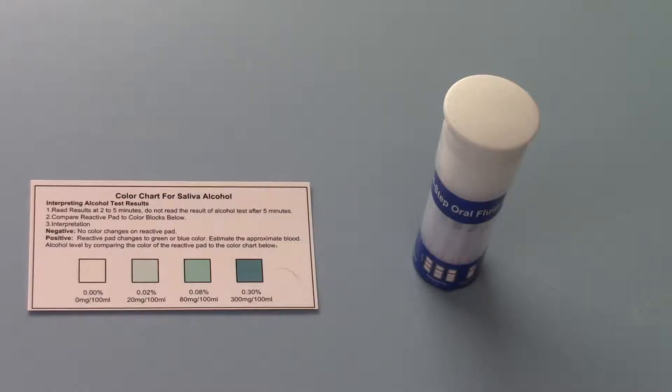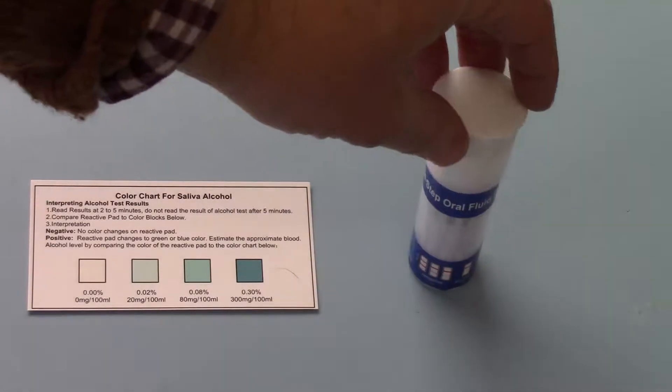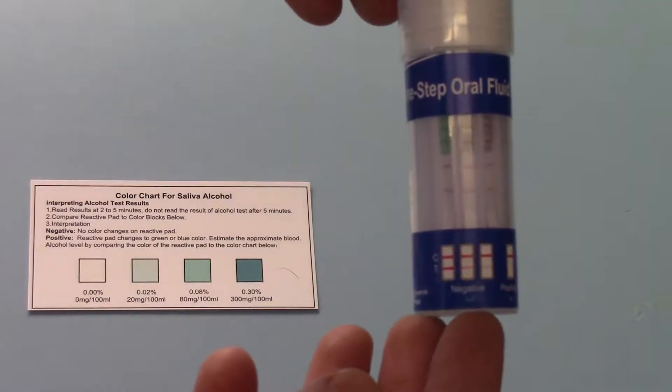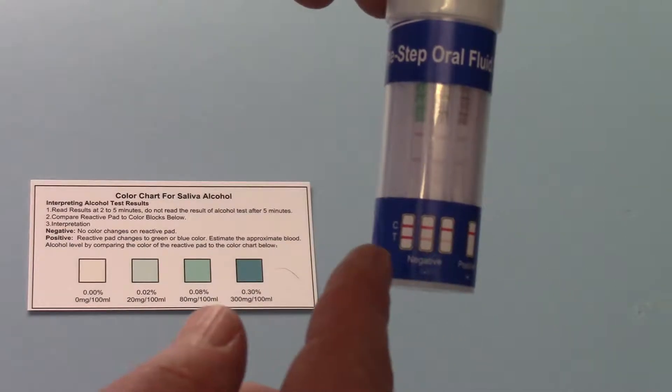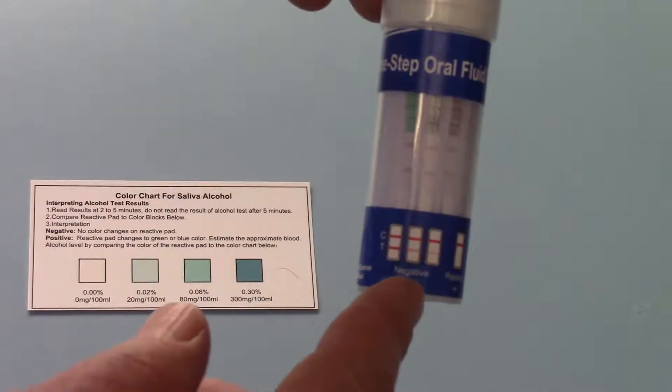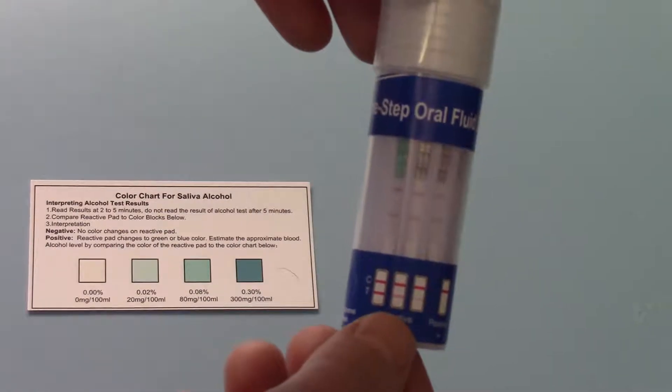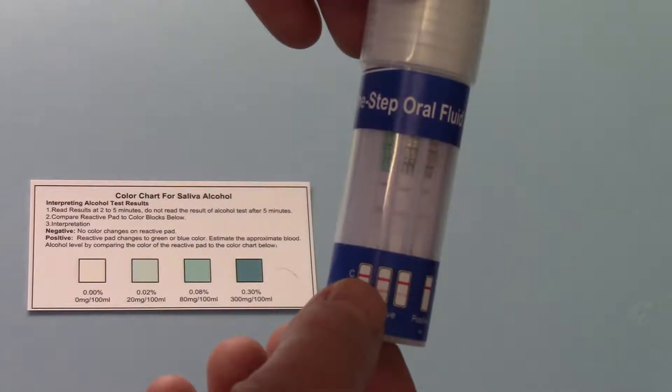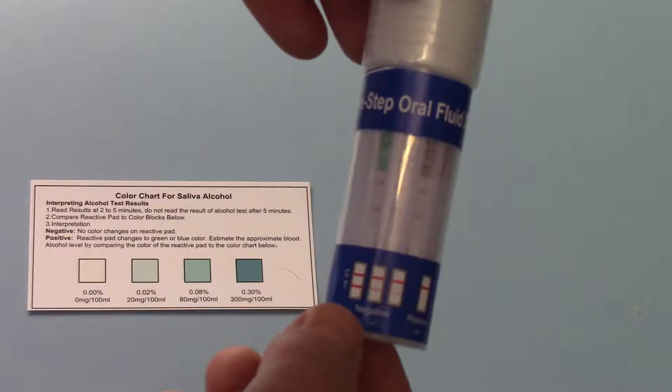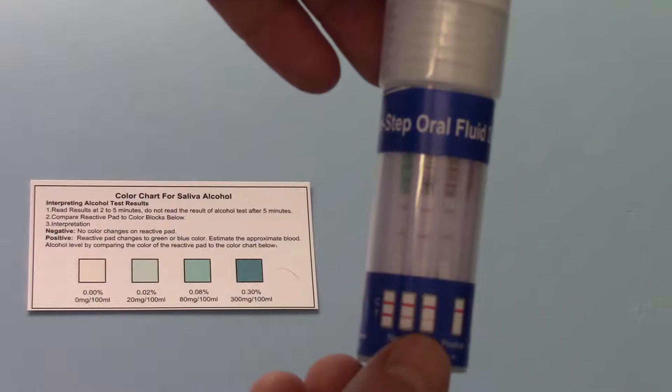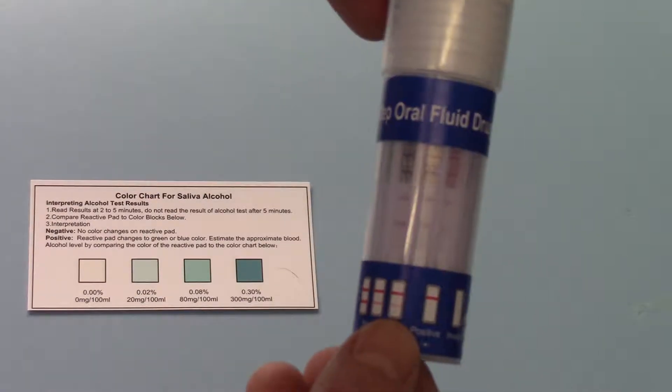This test has been running for five minutes and we have some nice clear results coming up on all six drug groups. On the bottom element of each of these barrels you're going to have some indicative result windows showing. This will show you a negative result where you've got a control line and a test line showing. It shows you the variation that can occur in the test lines from very strong through to very faint, but you should still always interpret those as a negative.